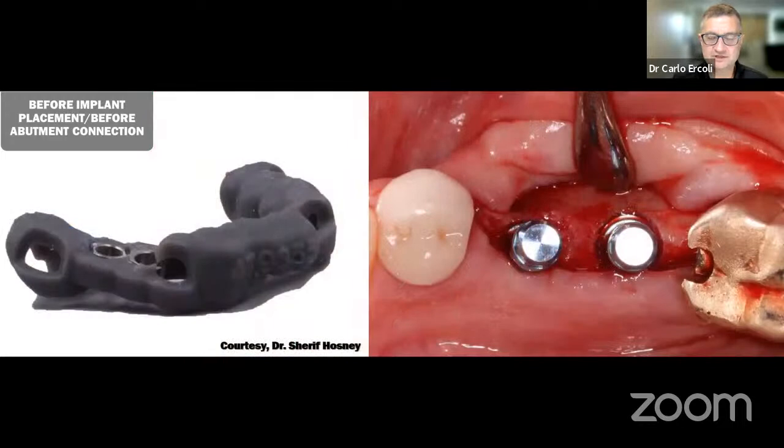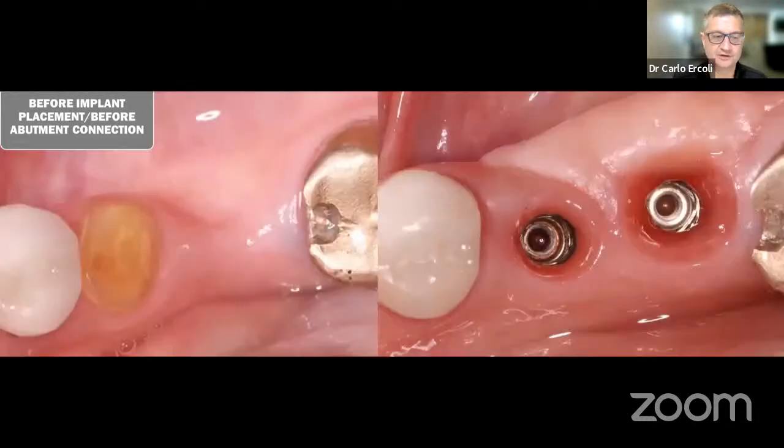And then once your soft tissue is thickened and keratinized in nature, we can progress and place the 2 implants here, as was done by Dr. Hosny, one of our implant fellows. So we can go from the picture on the left to the picture on the right, where now the tissue is keratinized, thick, and voluminous. So we have confidence that that area will be nicely maintained.